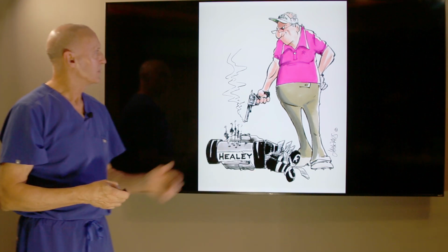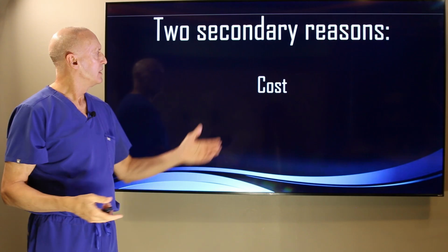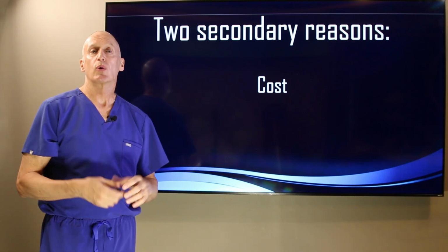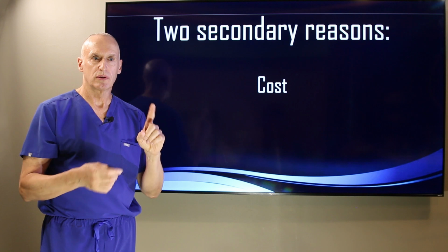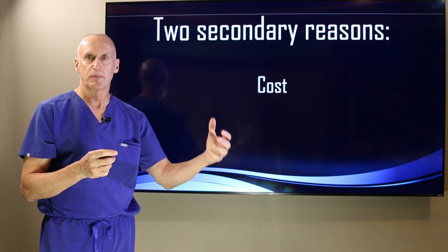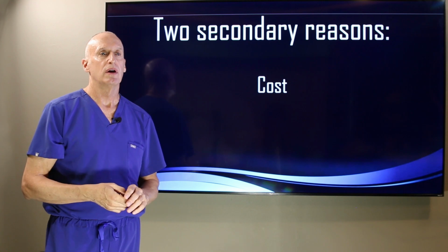So anyway, moving on. Two other reasons that make it more rare. It is more expensive. I'm going to release a video in the coming weeks about the surgical differences between FP1 and FP3, or implant bridges and all-on-4.